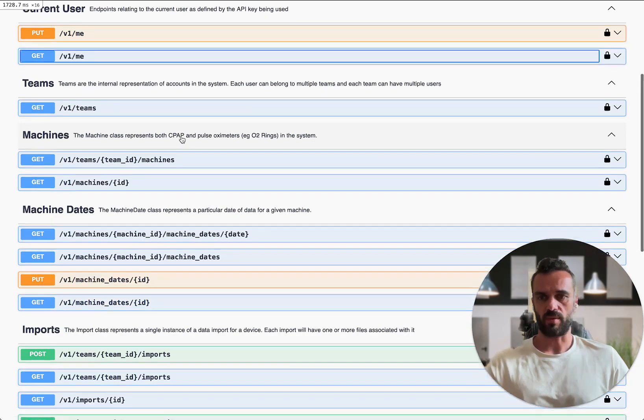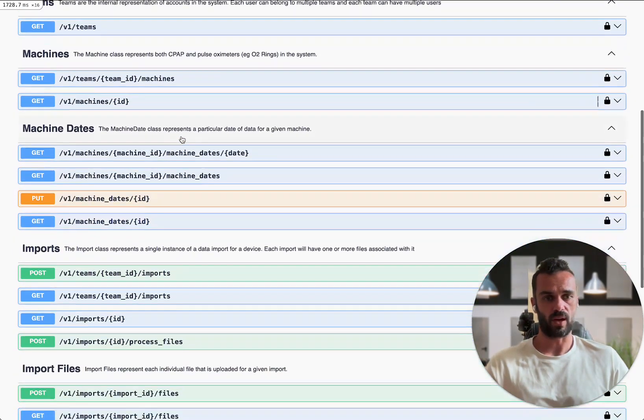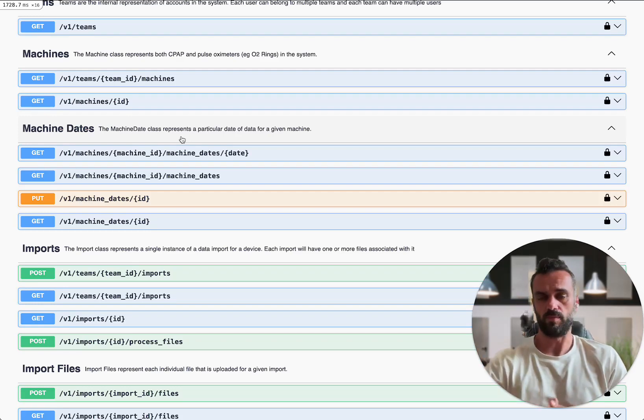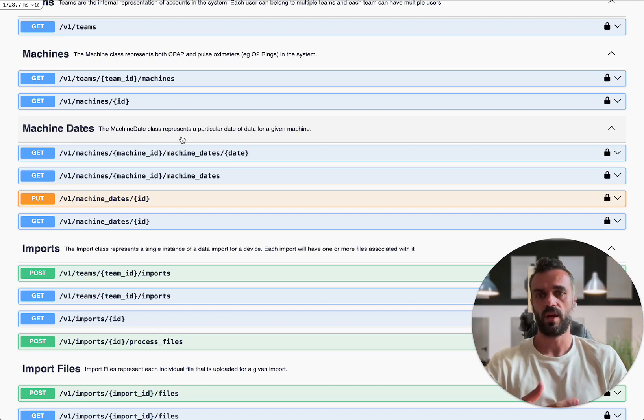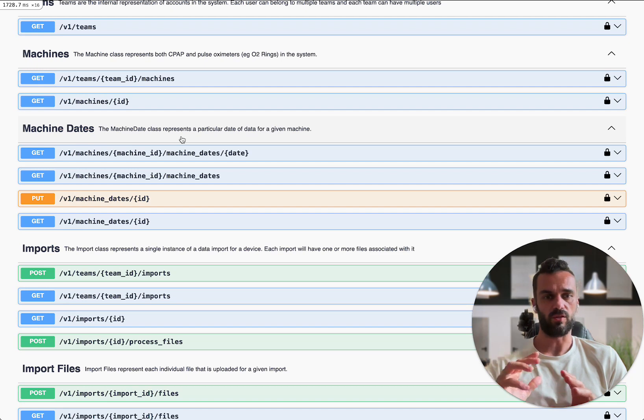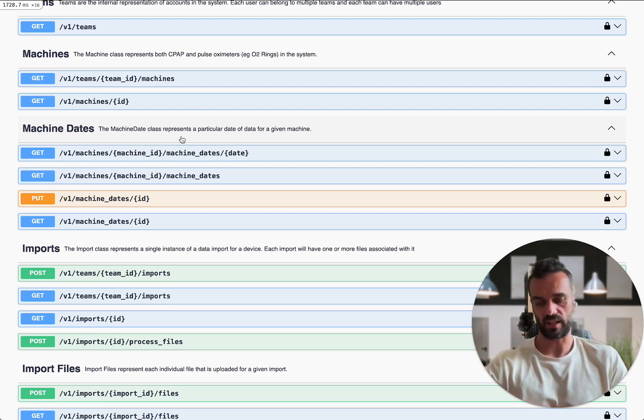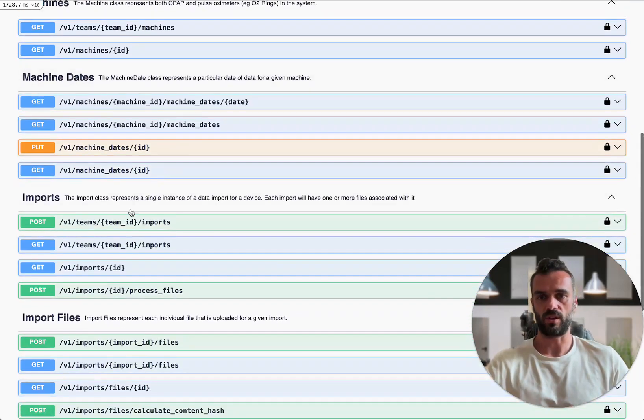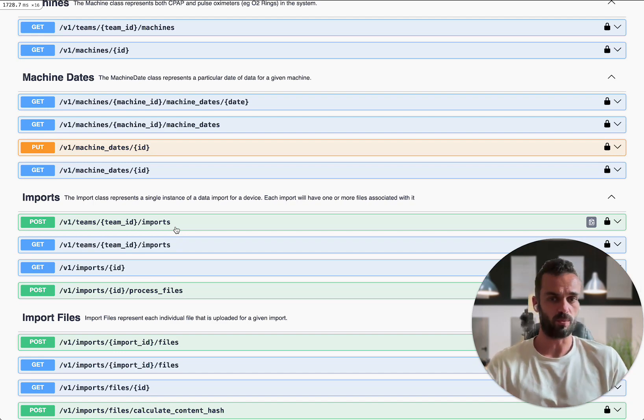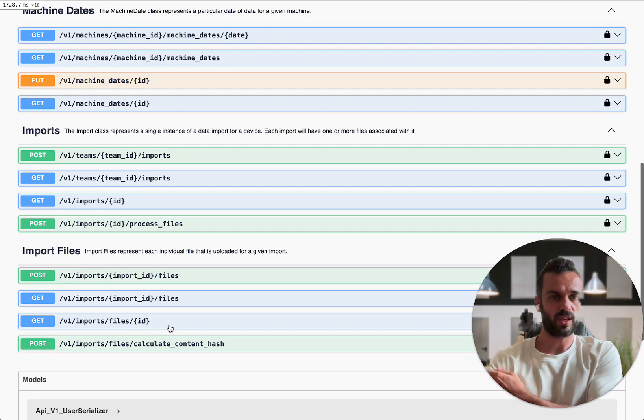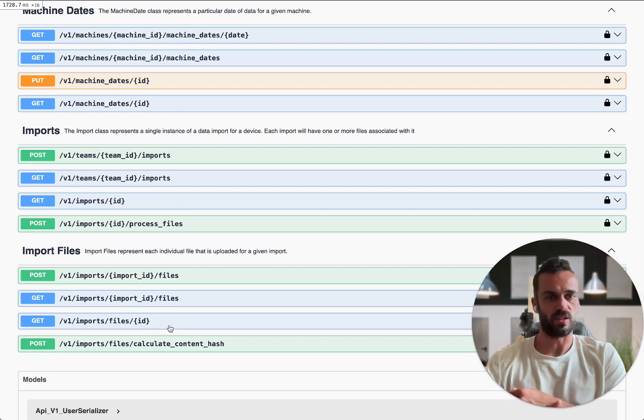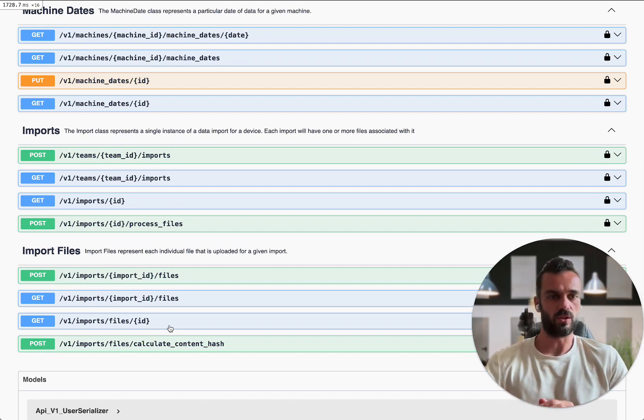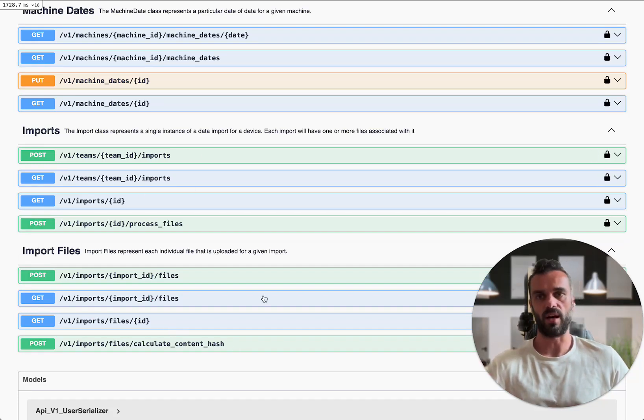First up you can create imports which is where you're going to be importing data. This is basically the functionality to build your own custom magic uploader. If you've been working on that and you've been playing around with getting your data in and you've been using like a headless browser or something to get the files into SleepHQ, you can now automate that full process. You can go down to this import section and it's going to explain to you exactly how to create an import object and then you can attach files to that object and then process the files. That's essentially what the magic uploader does. So you can now build that full functionality completely from scratch using the API.